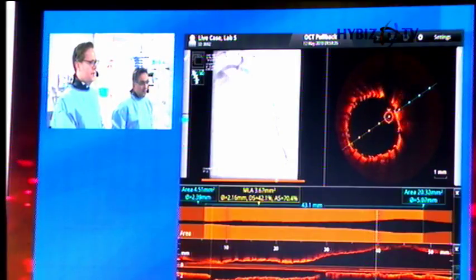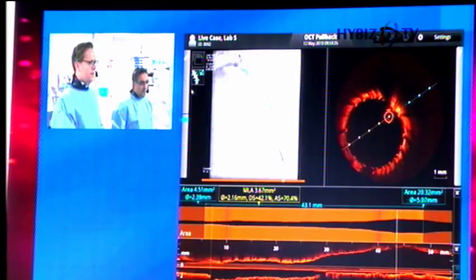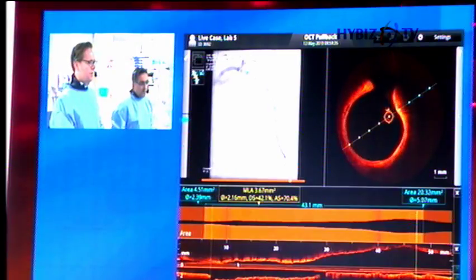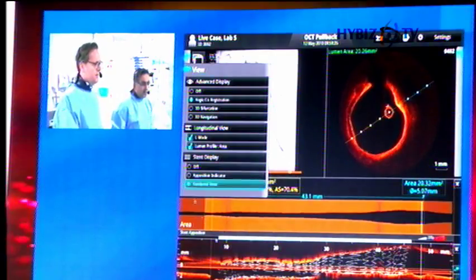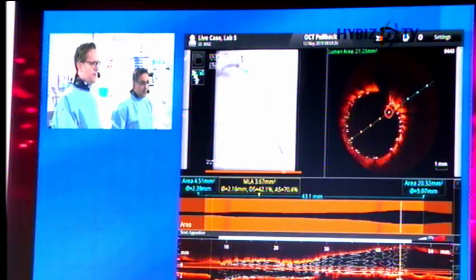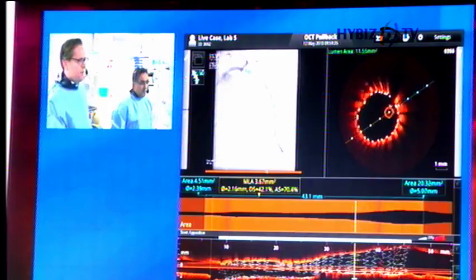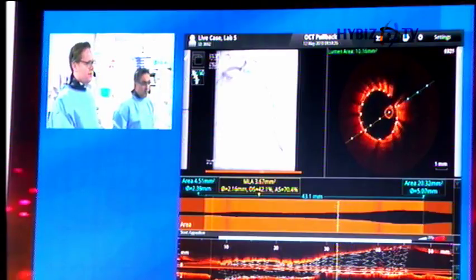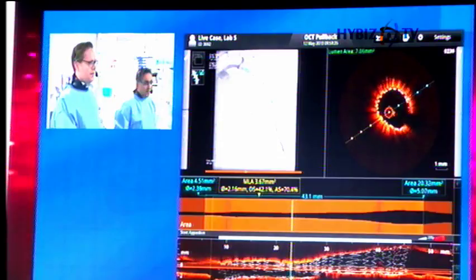And you can see here that even when you get slight irregularities within the vessel wall, the stent is beautifully apposed. And in a minute, we'll do our 3D rendering. You can see here all the way proximally, without any further work, it's beautifully apposed. No proximal split, so we didn't have to take a very aggressive 6mm balloon. Josh is now going to do the stent, and I think you can hopefully appreciate the technology shows that the red dots are the unapposed struts, and there's almost no red dots at all, which for a case like this is pretty impressive. Yeah, this looks good. But you can see there's almost no red dots at all.